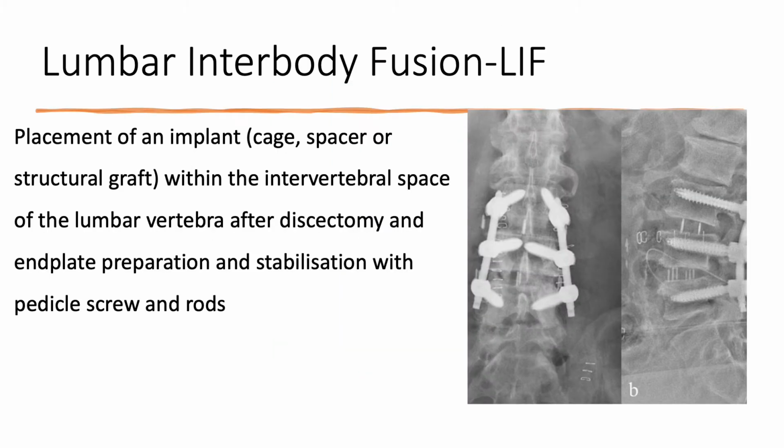There are various ways where you can do a lumbar fusion surgery. The most commonly used or the traditional techniques used to be posterolateral fusion and then the lumbar interbody fusion. In this video, I'll be talking mainly about various techniques of lumbar interbody fusion.